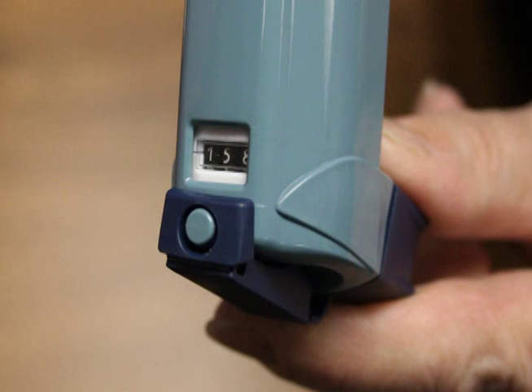Your inhaler may have a dose counter to tell you how many puffs are left. If your inhaler does not have a dose counter, ask your doctor or pharmacist for ways to know when your inhaler is out of medicine and you need to get a new one.